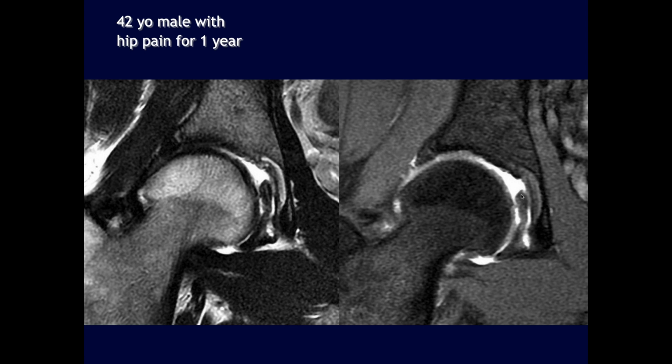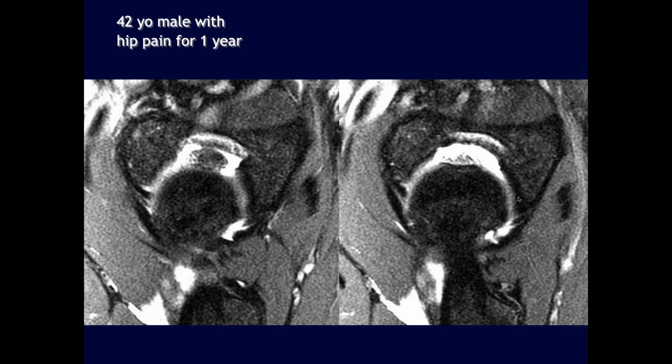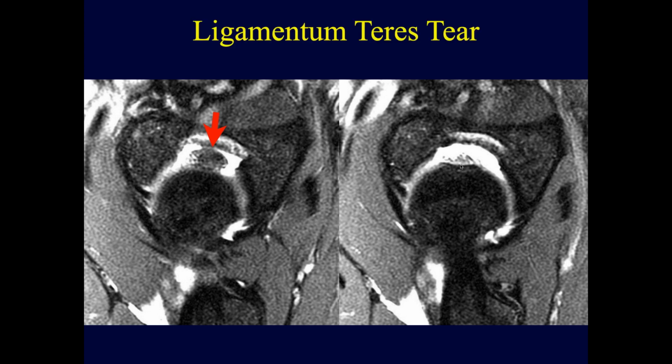But yeah, this is just one cut. You'd have to see all the cuts. But this was a complete tear of the ligament. It's kind of balled up there, and we don't see it going into the fovea in this case. So this was a complete ligamentum teres tear.